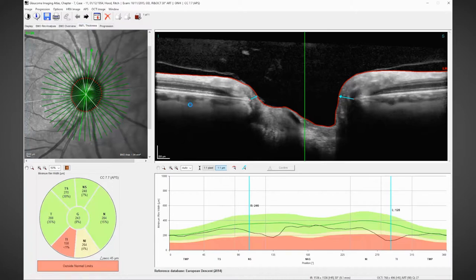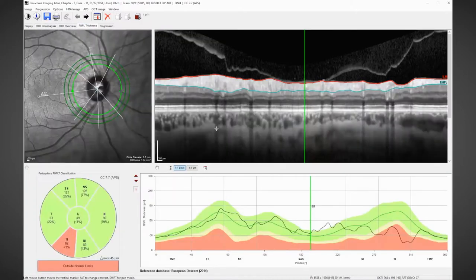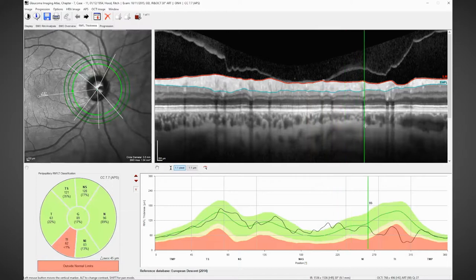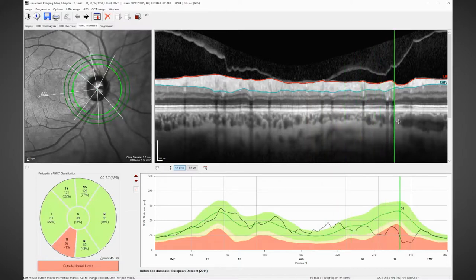Then we move to the peripapillary nerve fibre layer and we use the circle scan for this. We can see how the profile of the nerve fibre layer is and also the thickness of the nerve fibre layer.